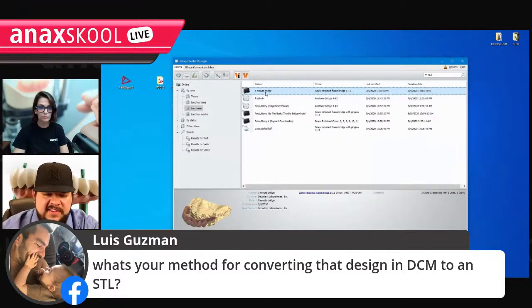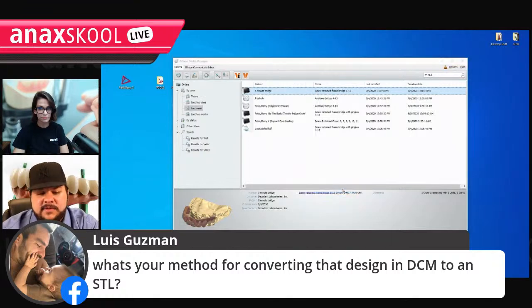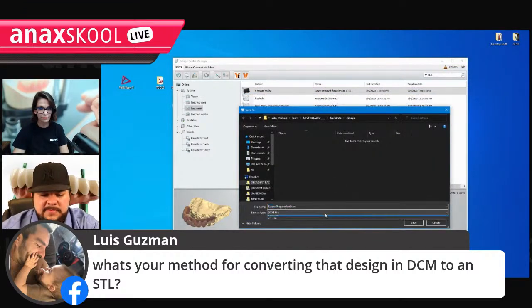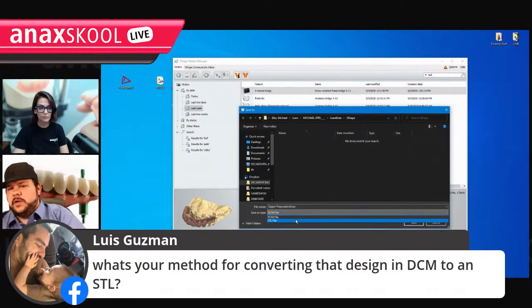But in this case, if I wanted to import that DCM arch that I just made, advanced export scan, and if you have the license for it, in the drop-down menu you'll be able to choose STL. If you don't have the license for it, you can't. And then you've got to go to other software.